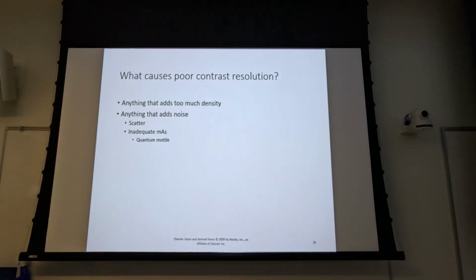Okay, so the one potential downside that I don't even know exists anymore is that as we increase our kVp and reduce our mAs, we introduce the possibility of quantum mottle. I don't know that anybody has, and the data set is insufficient, if anybody has, but I don't know that anybody's really done enough to try to introduce quantum mottle on our new machine. On our GE that we had, we couldn't get quantum mottle to show up.